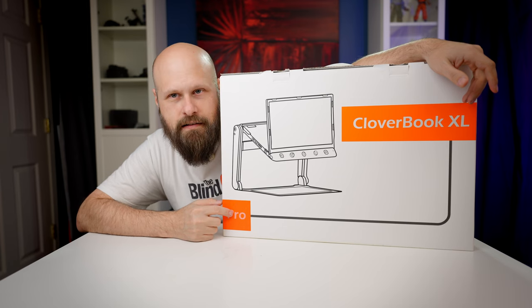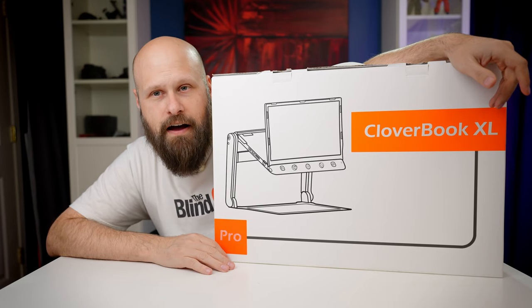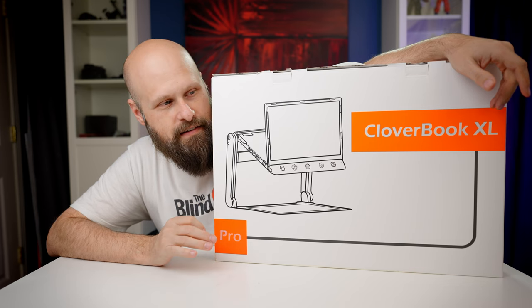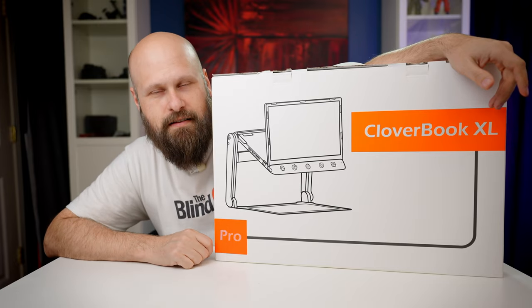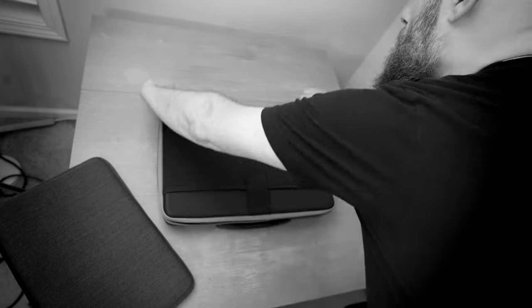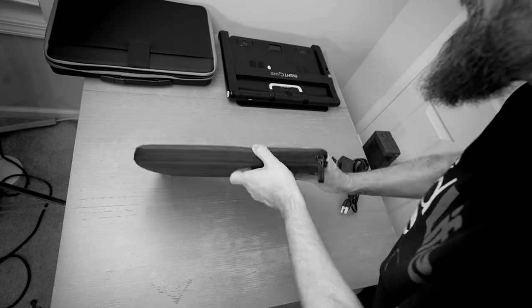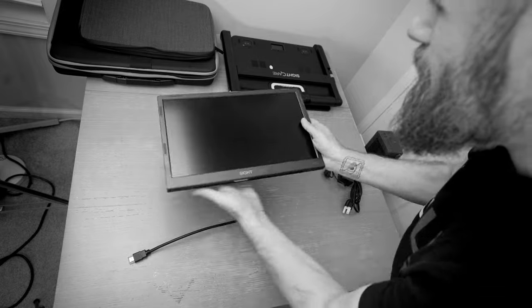First let's see what comes in the box, then we'll take a look at the device itself and check out the features. Then at the end I'll give my final thoughts, but seeing as how it's just the big brother to the CloverBook Pro with some extra cool features, I'll tell you from the beginning that I think this is a pretty awesome device. In the box you'll see the CloverBook Pro XL in a nice zippered hard case with a handle and D-rings for a shoulder strap. Also included is the extra screen in a padded zipper case, plus connecting cables and charging cables.